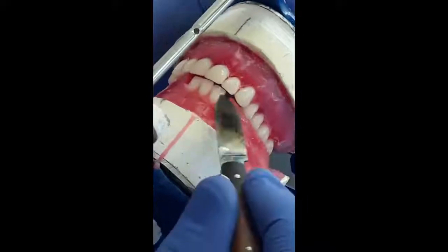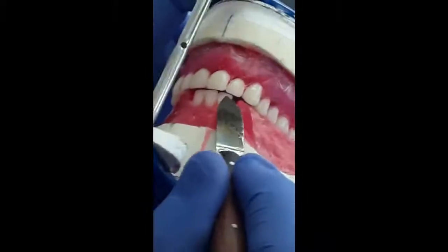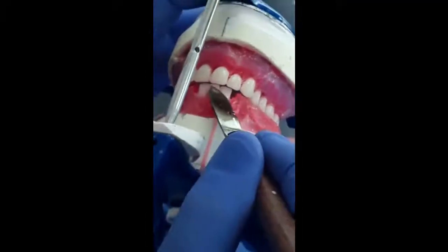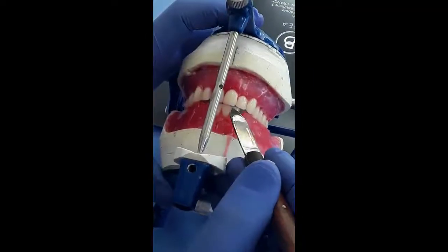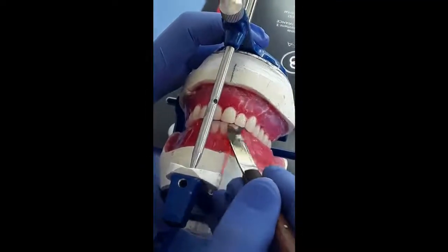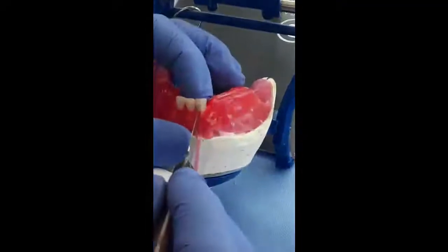Now you can notice that here we have overjet, and the overjet between the teeth must be equidistant, so all the amount of the overjet must be the same, an equidistant overjet.